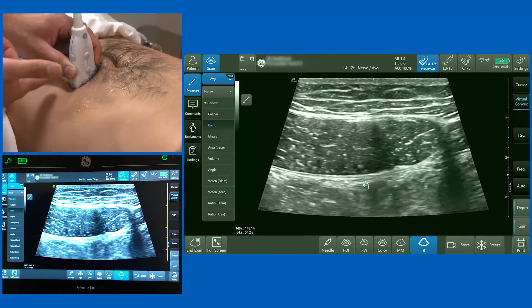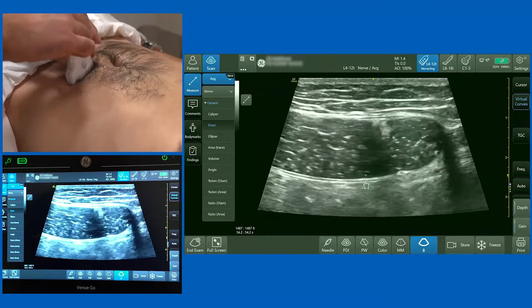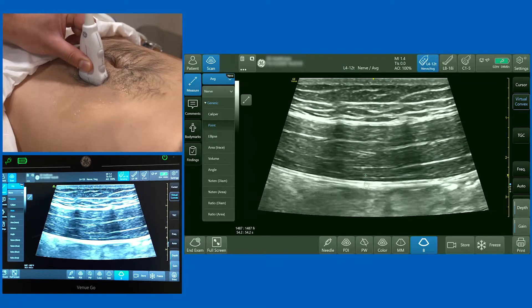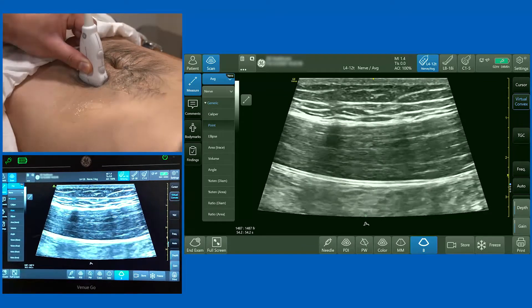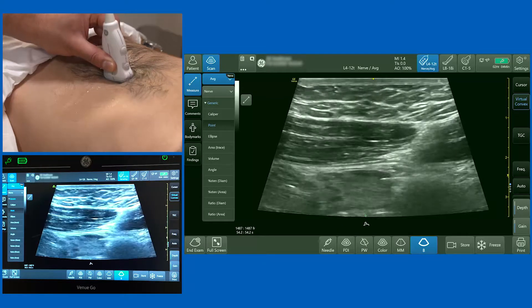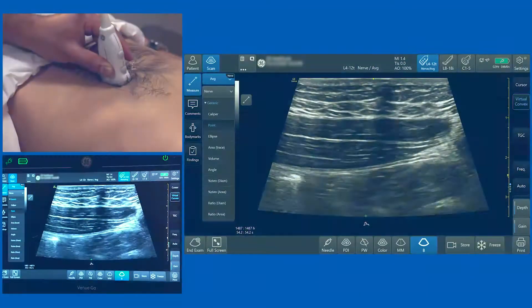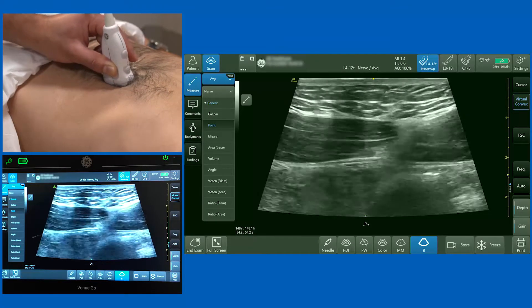Some people opt to site catheters with an alternate probe orientation. I'm going to take the transverse scan and rotate the probe through 90 degrees. Now I'm scanning along the long axis of the muscle. You can still see the posterior rectus sheath and transversalis fascia at the bottom of the screen. As I slide up, you can see the interdigitations of the rectus abdominis — the six-pack segments — with the muscle visible in long axis.